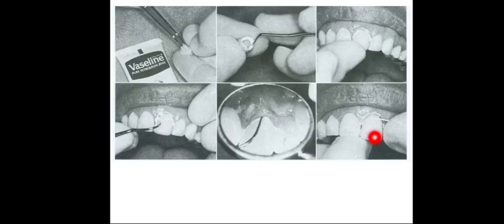The temporary cementation material is zinc oxide eugenol because eugenol has a sedative effect on the pulp and is mechanically acceptable, having moderate strength and moderate mechanical properties, so that it can be removed easily in the insertion visit.